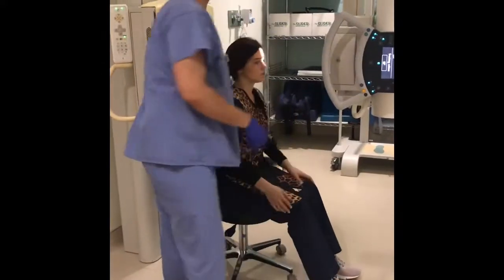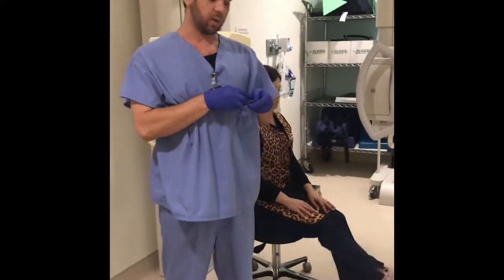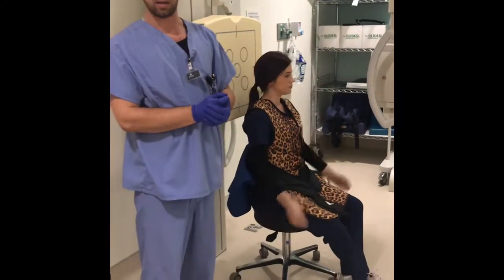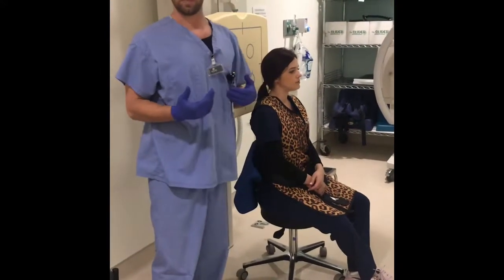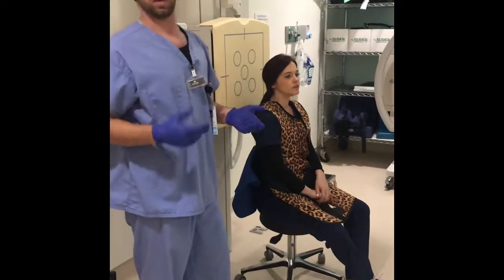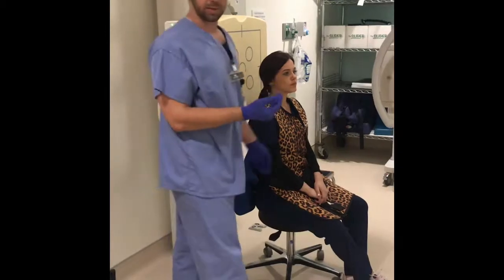All right, and for the last one, you want to try and be quick because it's quite uncomfortable for a patient, especially if they've been in a motor accident or anything, just checking their air fluid levels. They might have limited range of motion, so throwing their head completely back could just be uncomfortable, tiring, or disorienting.